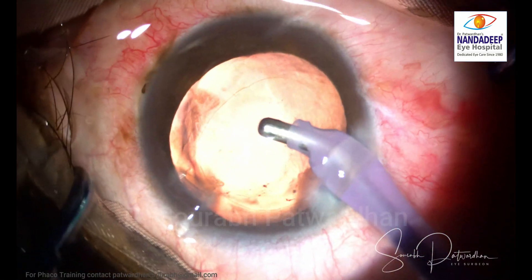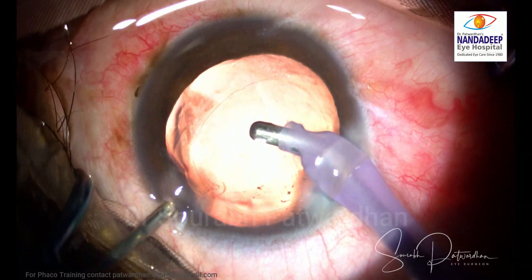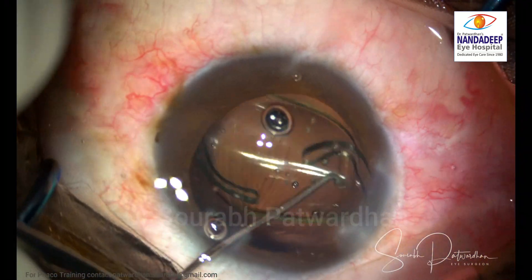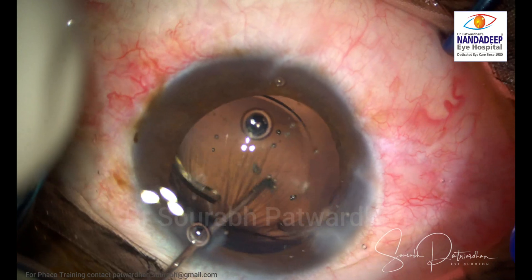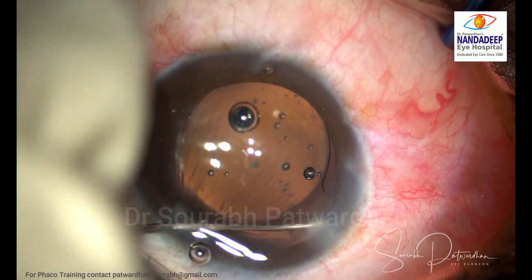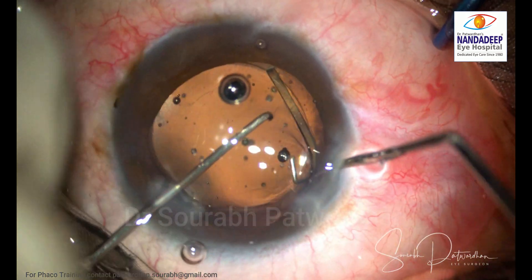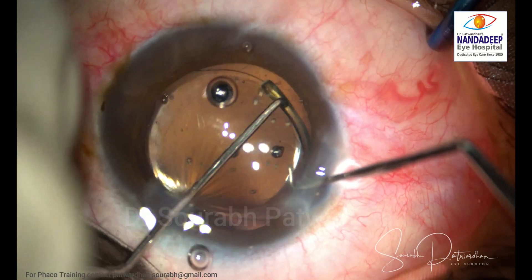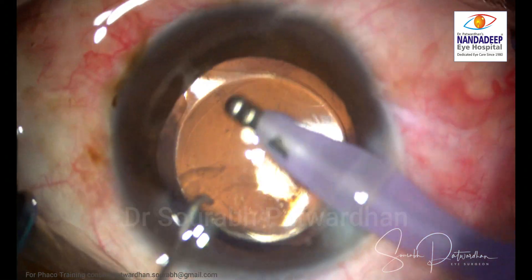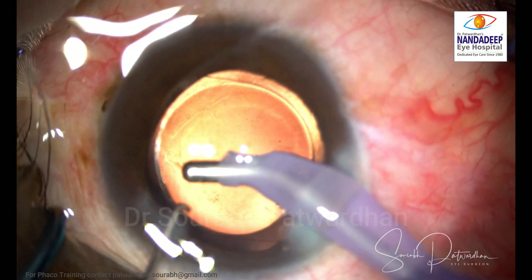As I move further I will be injecting OVD again — whenever you remove the probe it is better to inject OVD first to avoid vitreous prolapse. The OVD is now in the anterior chamber and into the bag. To avoid excessive pressure over the bag I use the bi-manual method for the trailing haptic, which had gone into the sulcus, so I just pushed it back into the bag.